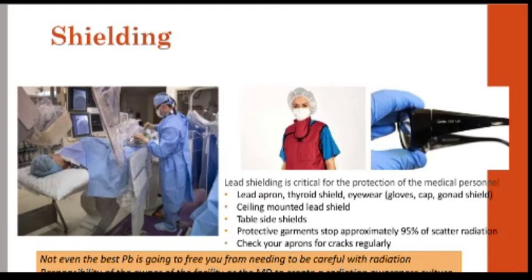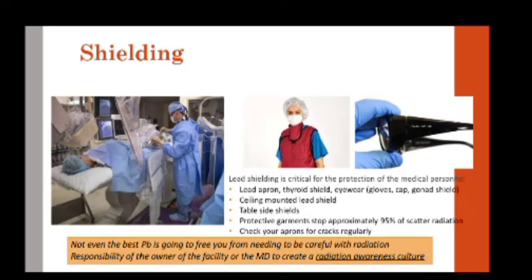Not even the best lead is going to free you from needing to be careful with the radiation. It is the responsibility of the owner of the facility or the MD to create a radiation awareness culture.